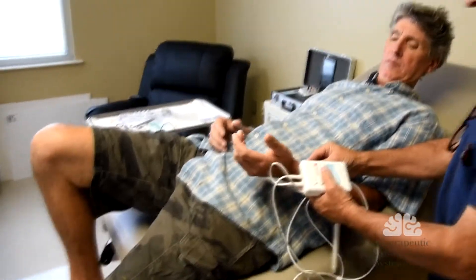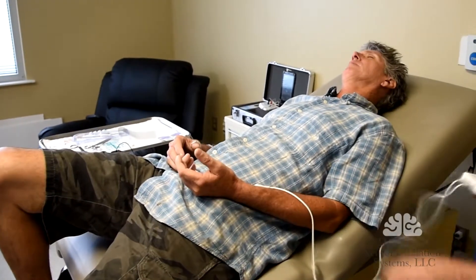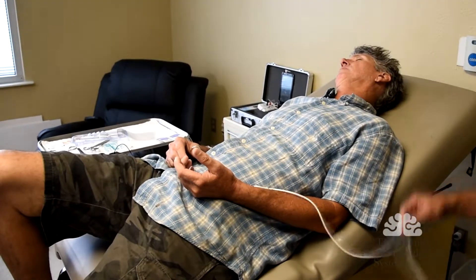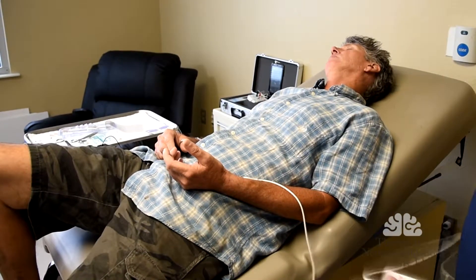We're going to find the points. We install the ground and we test the device.